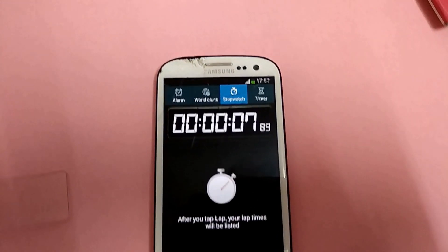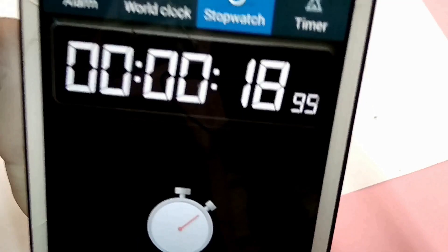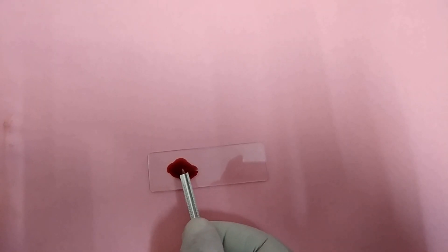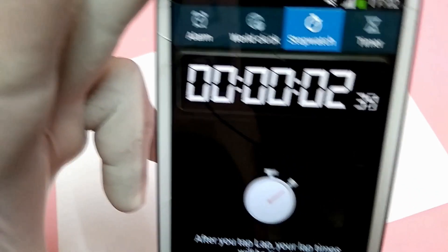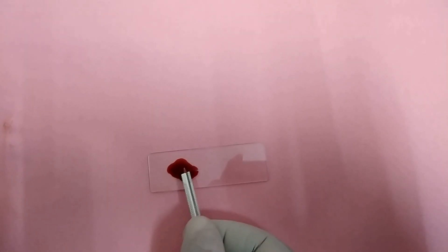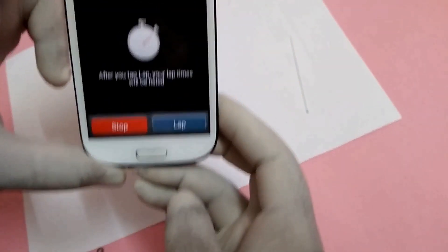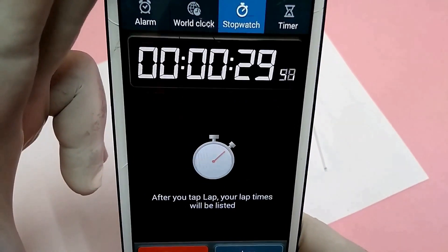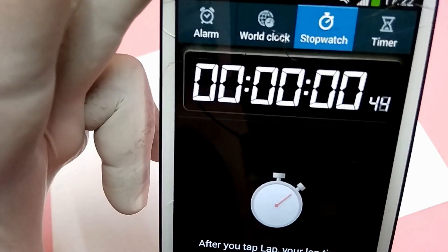Pick up with the lancet at every 30-second intervals. The time at which a fibrin thread is seen — that will be the clotting time.